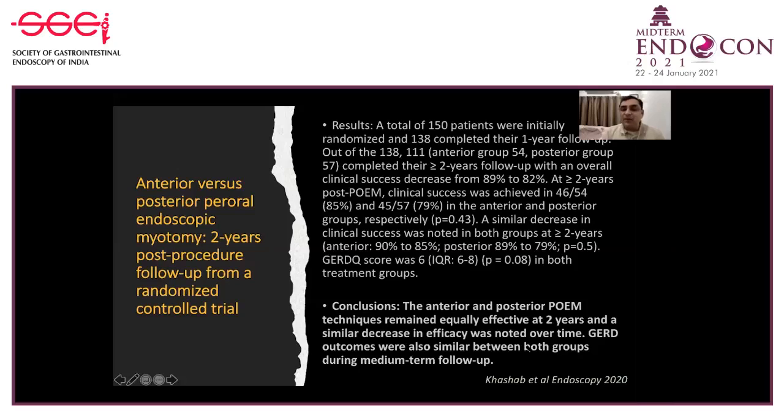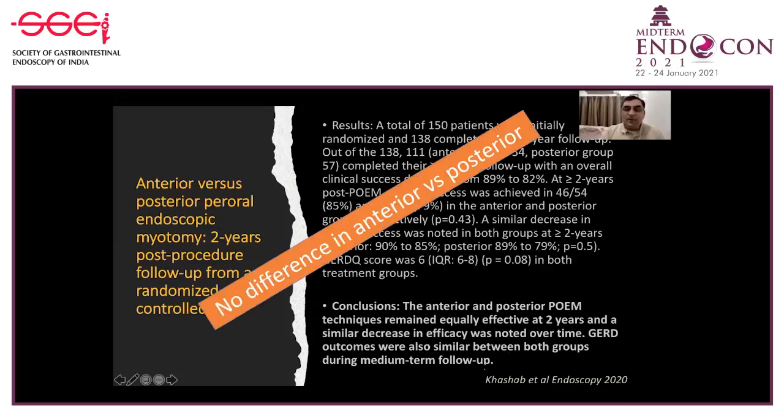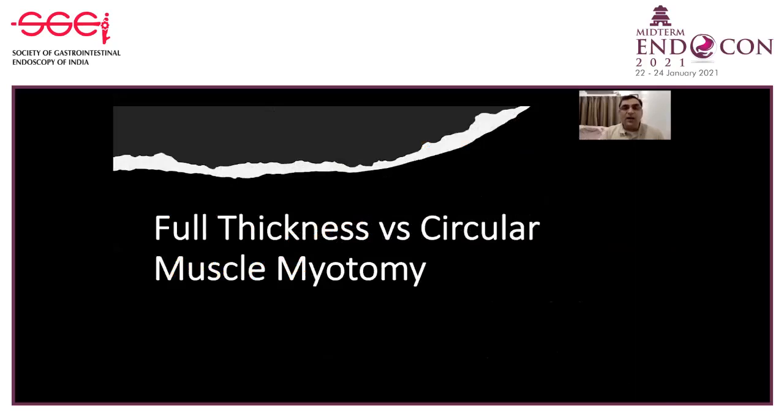Again, this last paper, which has come just in 2020 by Khashab from Johns Hopkins, concluded a 2-year follow-up post-procedure for anterior versus posterior, and they concluded that the anterior and posterior POEM techniques remain equally effective at 2 years and have a similar decrease in efficacy over time. GERD outcomes were similar between both groups during medium follow-up, and therefore again, no difference anterior versus posterior. So anterior or posterior, you can decide depending on how comfortable you are doing an anterior or posterior.